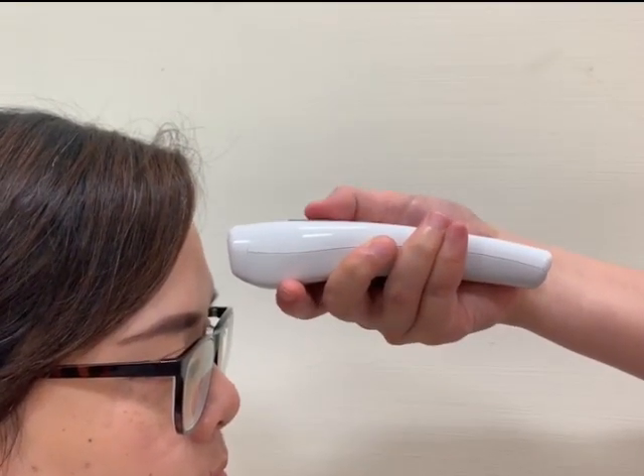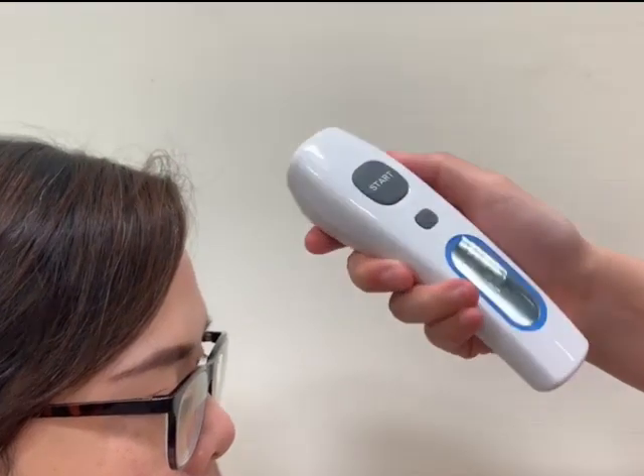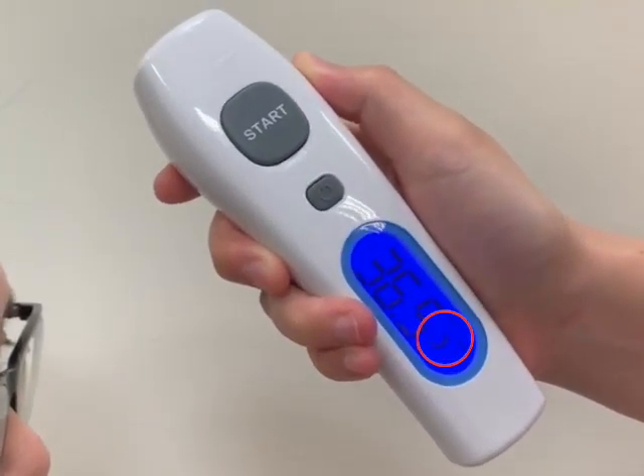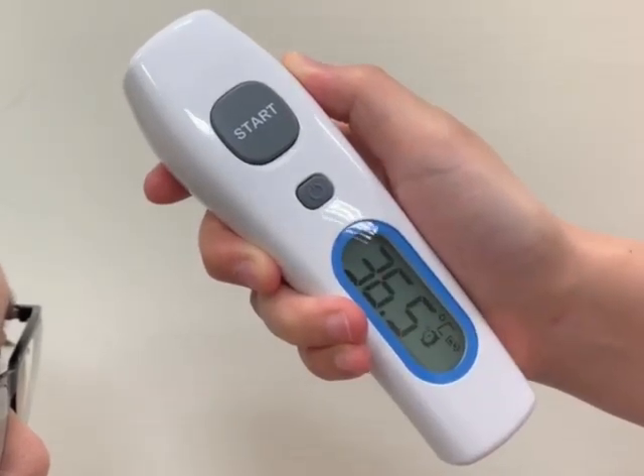You will hear a beep sound which indicates the newest measurement is taking place. The blue LED backlight will be automatically turned off after measurement.